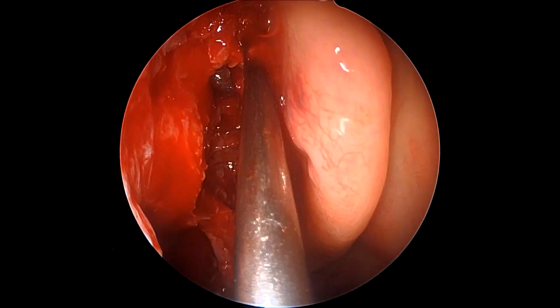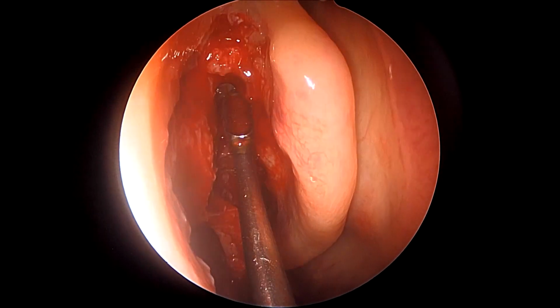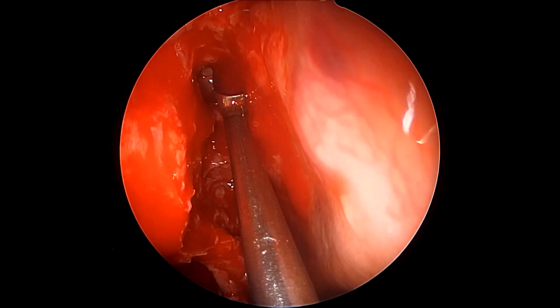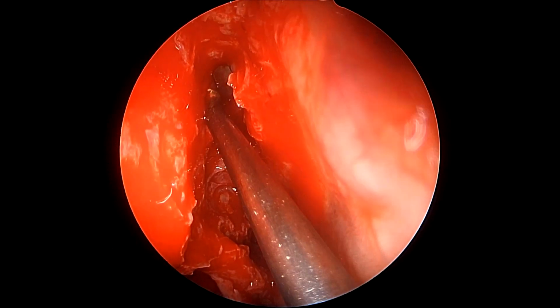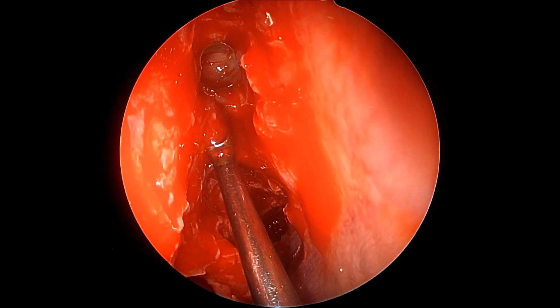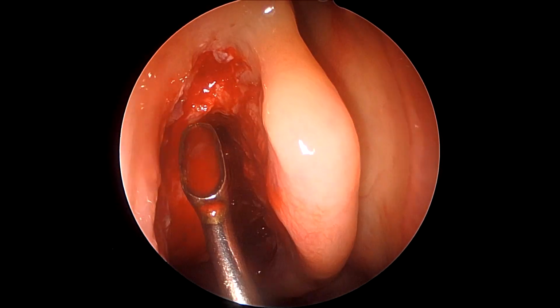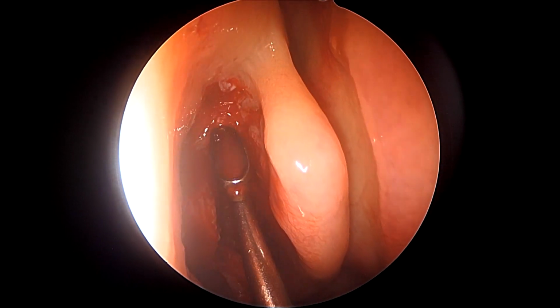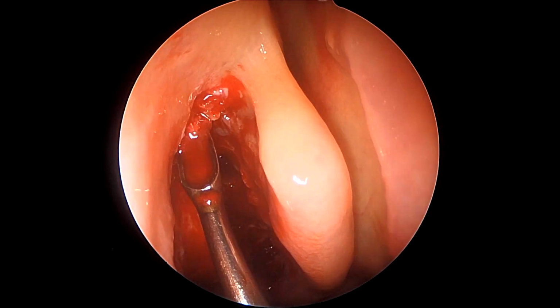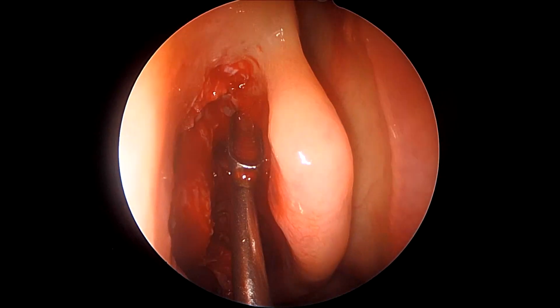Now again, once we have used our landmarks, we use the frontal sinus curette to again back fracture. This is a wonderful instrument. We can always palpate the height of the structure that we are removing, and back fracturing it gives us a fair amount of security against going through the ethmoidal skull base. Now this is pointing towards the agger nasi, and again this can be fractured from posterior to anterior.